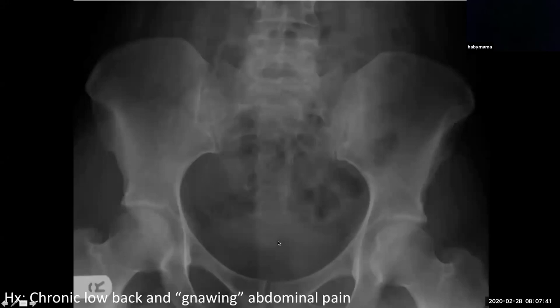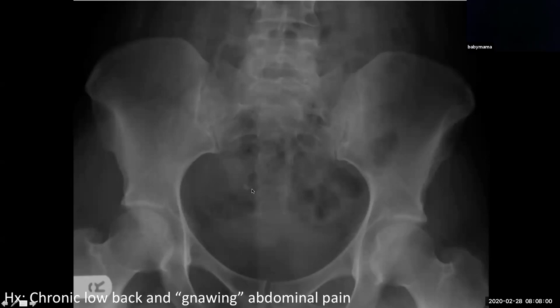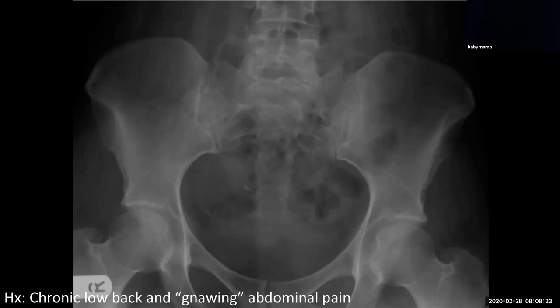How about this case? A female patient with chronic low back pain and gnawing abdominal pain. What we have here is a subtle calcification — notice the homogeneous appearance, chalk-like, cloud-like, lacking trabecula and cortices, so it's not ossific. This is a calcific sub-centimeter density projecting over the right lower aspect of the sacrum. This case was a pelvic dermoid — not everything presenting similarly is bone related. This was a proven case of a dermoid cyst chronically leaking fat into the peritoneum, causing chemical peritonitis. The patient was taken to surgery, and the dermoid cyst was removed to treat the chemical peritonitis and prevent future possibility of ovarian torsion.